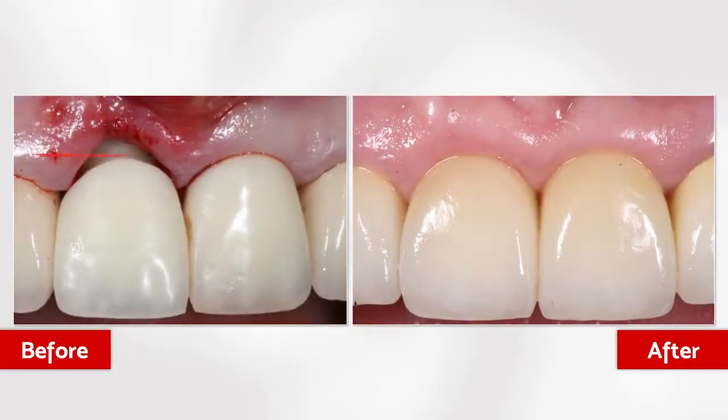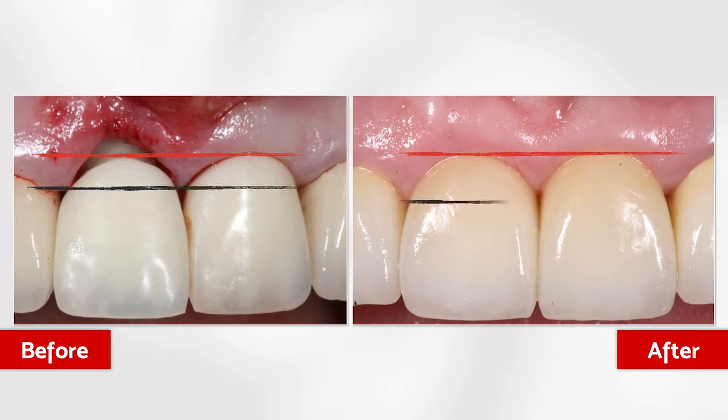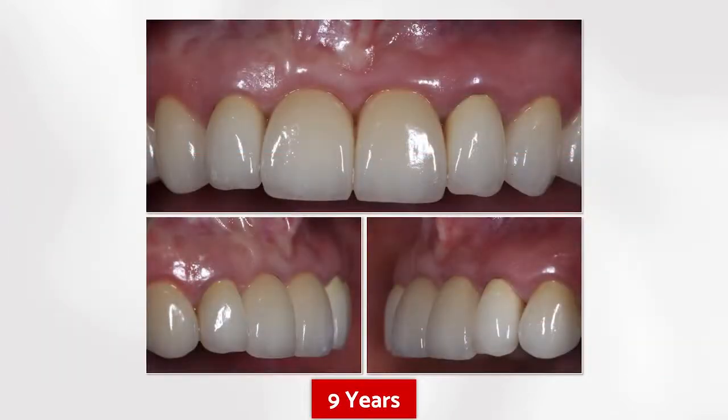Here before and after, we had an uneven gingival margin, and now you can see a symmetrical gingival margin position. But not only that, we have the improvement at the papillary height position. This is the follow-up after 9 years. I can say that we got a soft tissue stability around the implants.